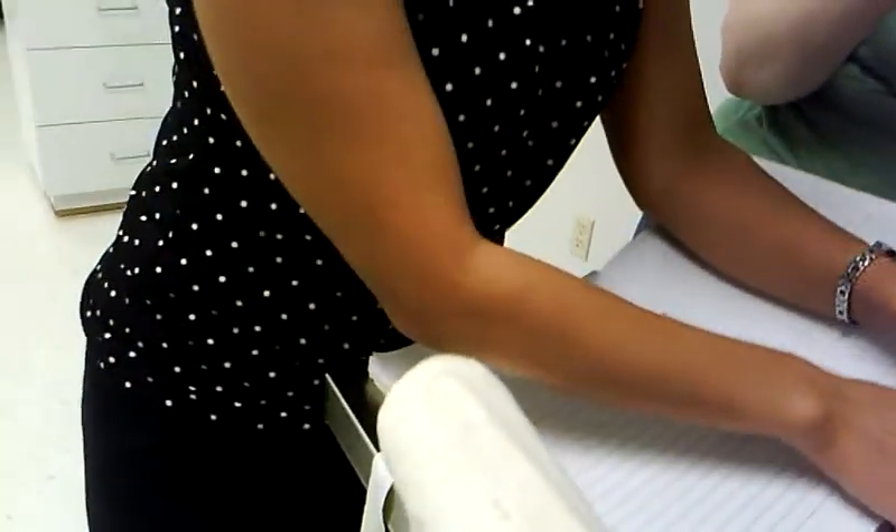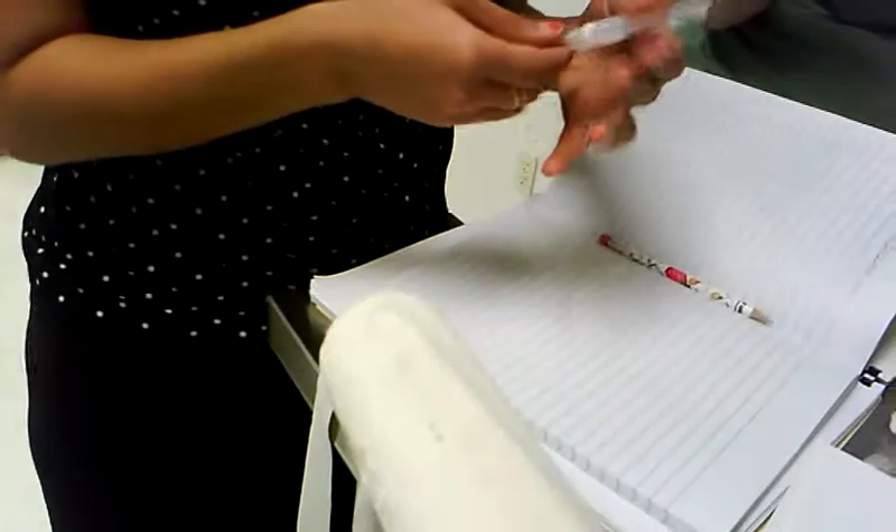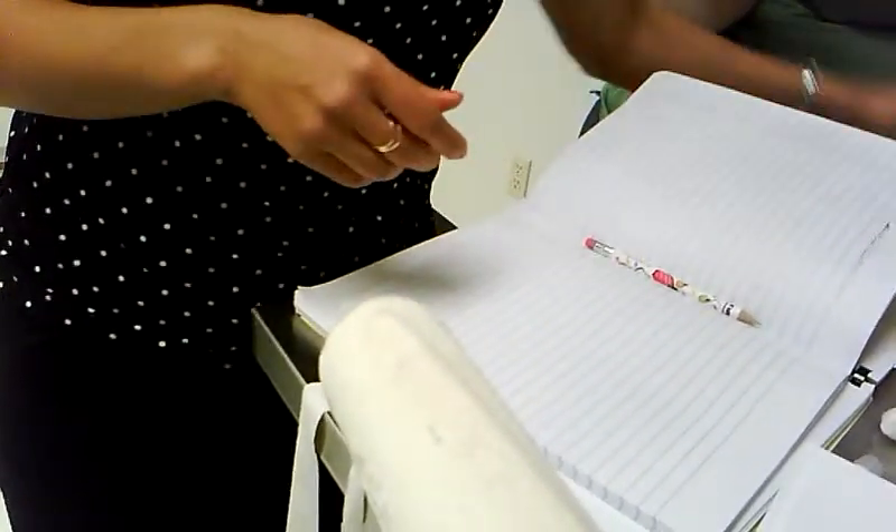Don't you scrub first and then put alcohol? Then you pick the needle. You're going to have to get another one. We flush this beforehand when you're checking it.